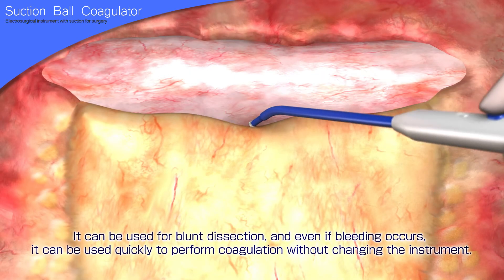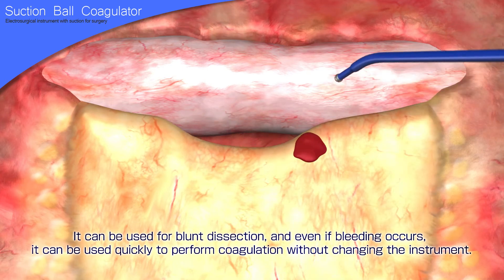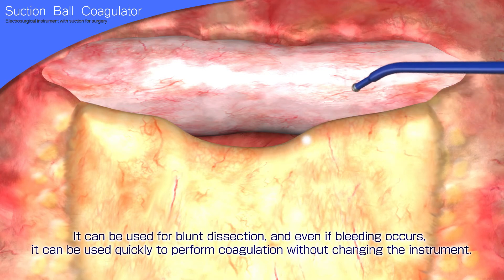It can be used for blunt dissection, and even if bleeding occurs, it can be used quickly to perform coagulation without changing the instrument. It is useful for such procedures as lymph node dissection and hemostasis of oozing during tissue dissection.